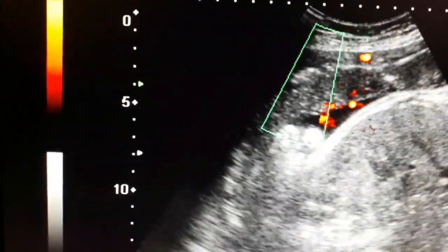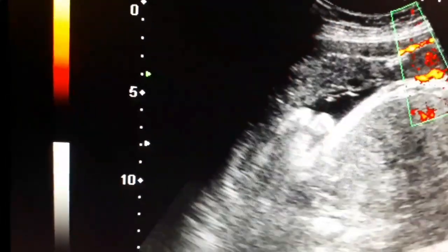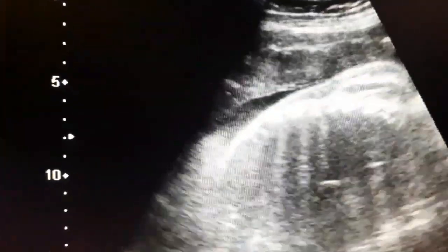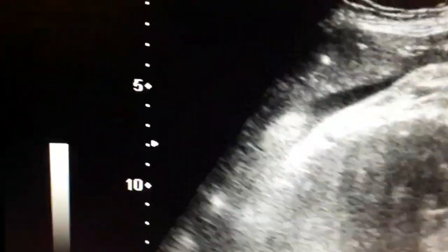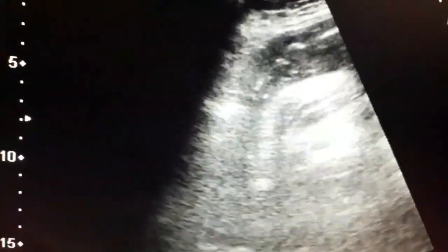Look at the interface of the placenta with the uterine wall. I am putting color Doppler, which will differentiate the placenta from the uterine wall. Look at the lower end of the placenta, and you can appreciate a fine echogenic line between the uterine wall and the placenta.